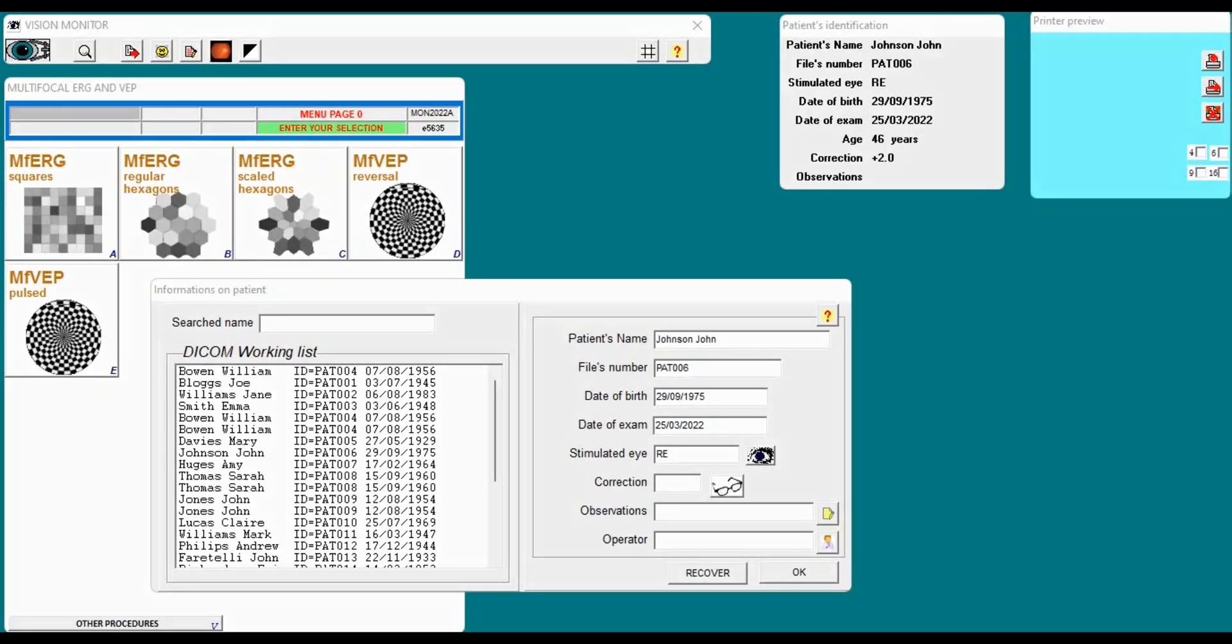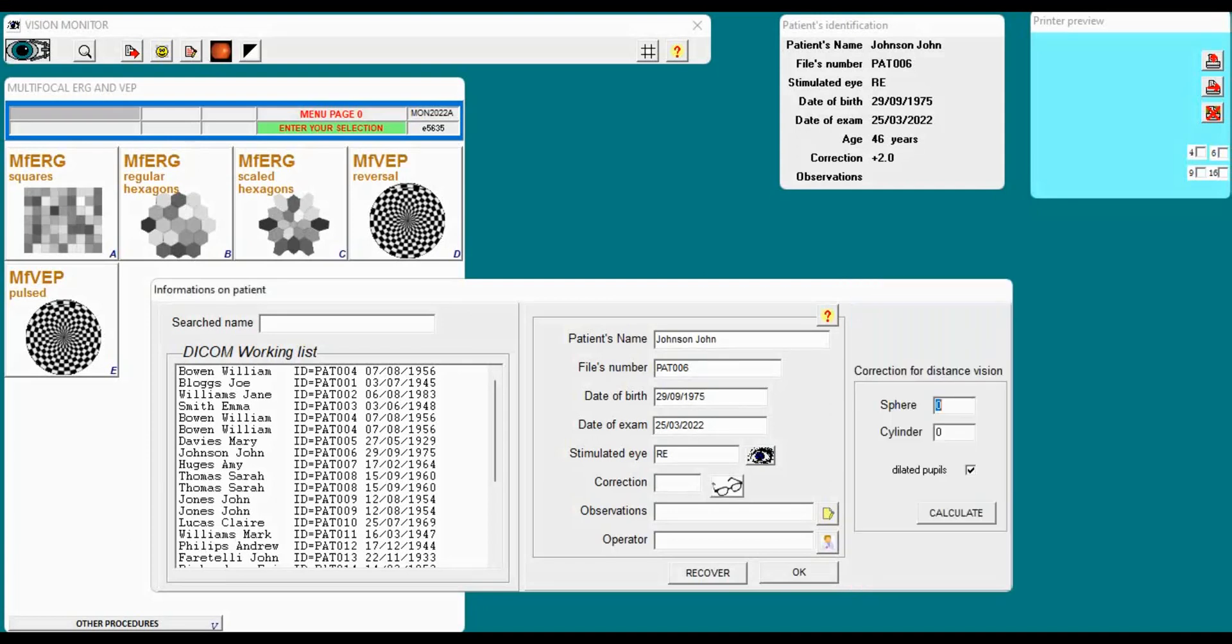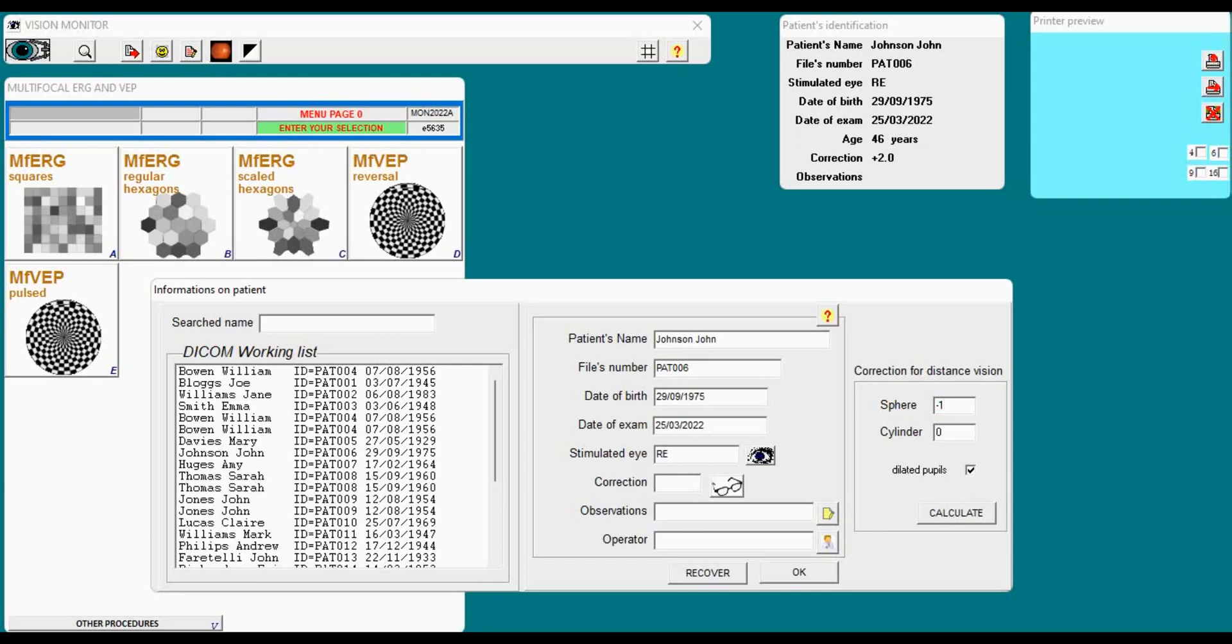Now I can choose the correction for refraction for that patient. I click on the small icon on the menu that opens a new menu where I can enter the spherical and cylinder value for distance correction of that patient.